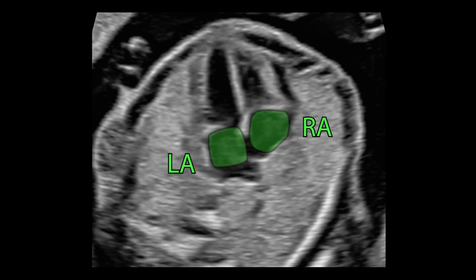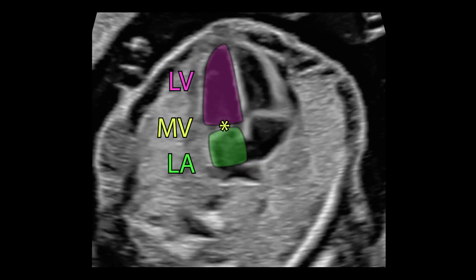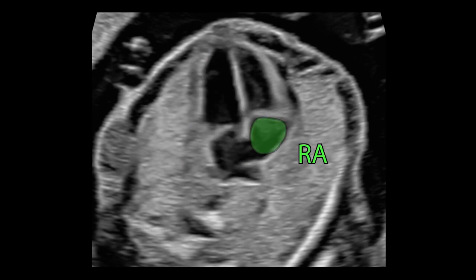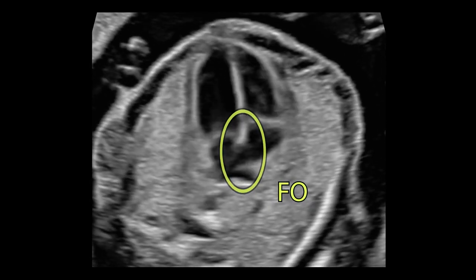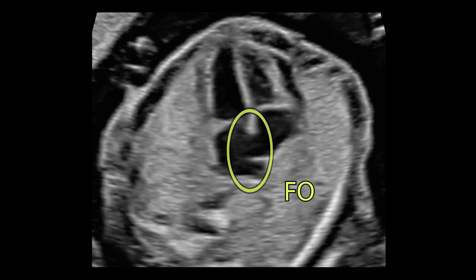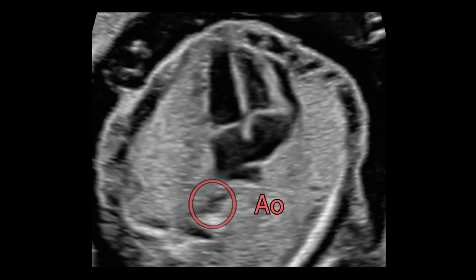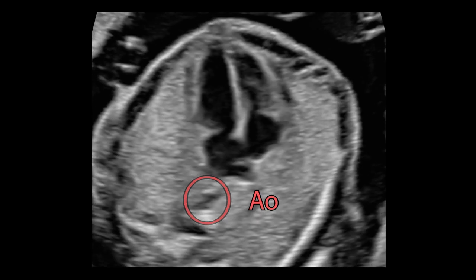Both atria are nearly equal in size. The left atrium is angular in shape, and the pulmonary veins are connected to it. The left atrium is connected to the left ventricle by the mitral valve. The right atrium has a more circular shape and connects via the tricuspid valve to the right ventricle. We can recognize the foramen ovale and its leaflet, the flap valve. The aorta is seen behind the left atrium in front of the spine.